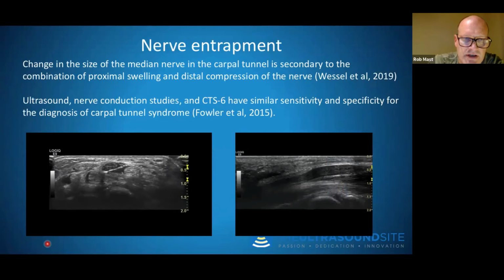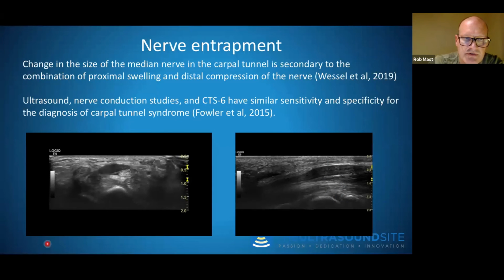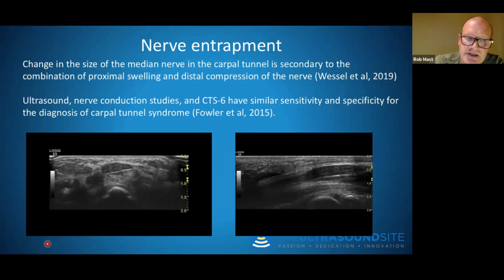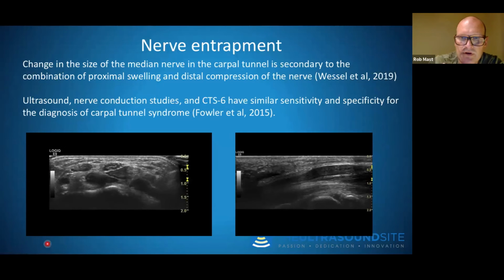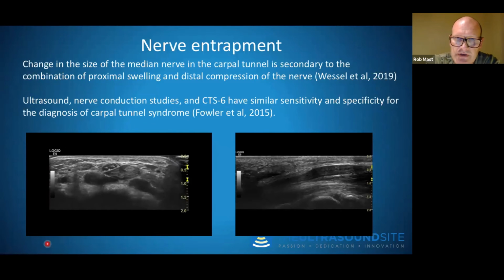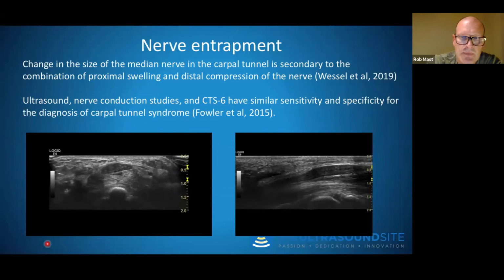You can see that where the nerve is not compressed, it is relatively normal in terms of size and also very normal in terms of the echogenic structure, so it gives you that bright and dark intermingled image that you would expect of a nerve. Whereas when it becomes much bigger further down or further up, wherever it is, you see it becomes darker. And the corresponding longitudinal image is on the right-hand side.